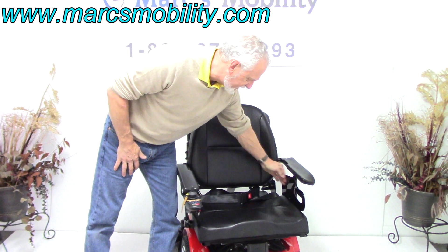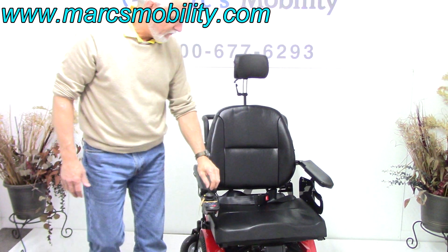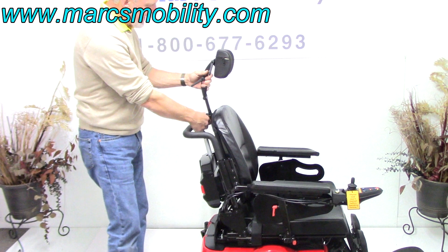You've got lateral guards on each side, which is very nice — they keep your legs in. There's also a fully adjustable headrest that can be removed.